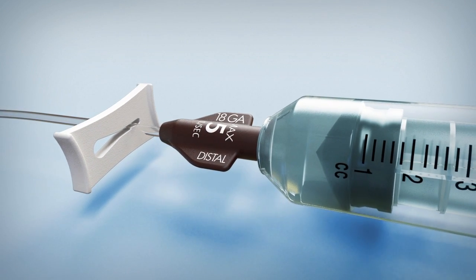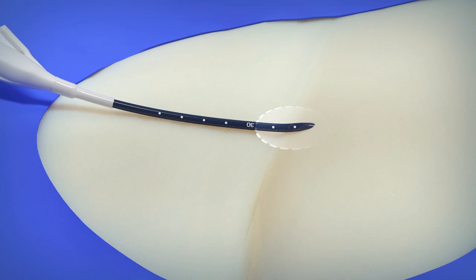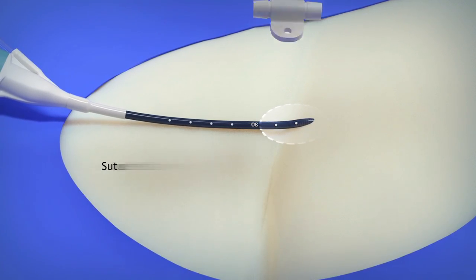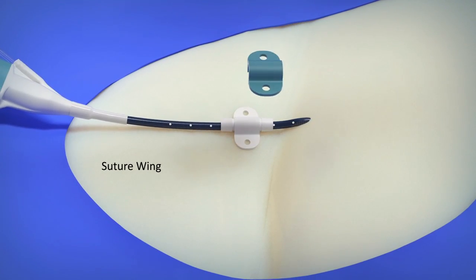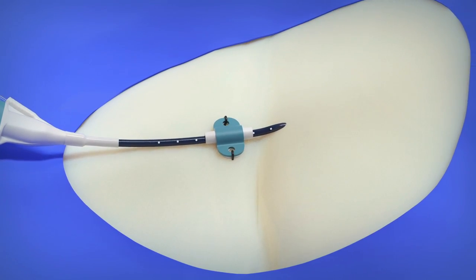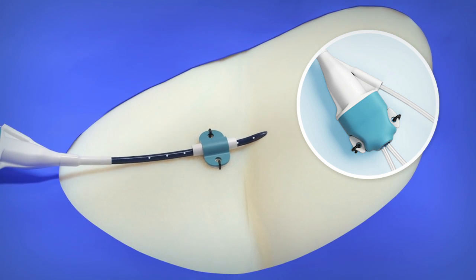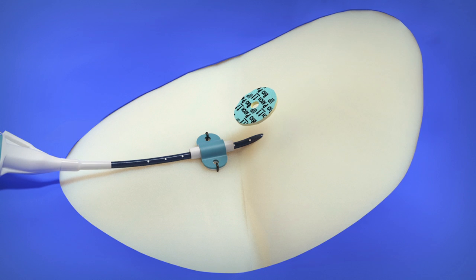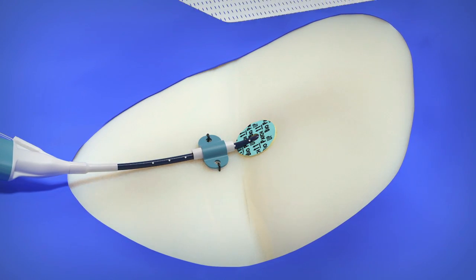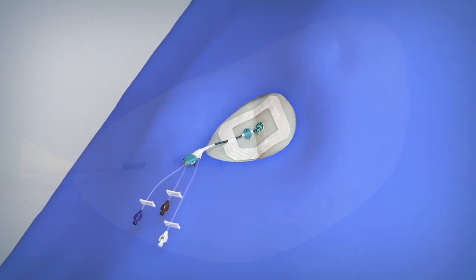Engage the slide clamps after flushing to prevent blood loss, allowing space for proper positioning of a biopatch or alternate anti-infective dressing around the catheter at the access site. Place the sutures through the loops of the catheter hub to reduce the possibility of inadvertent decoupling of the catheter hub. Place the biopatch or alternate anti-infective dressing around the catheter at the access site. Apply the Tegaderm dressing over the access site and dress the access site per hospital protocol.